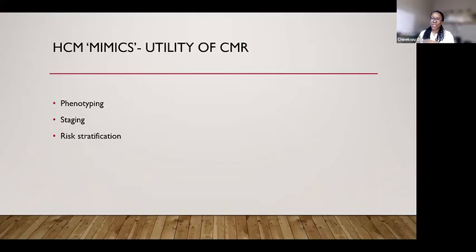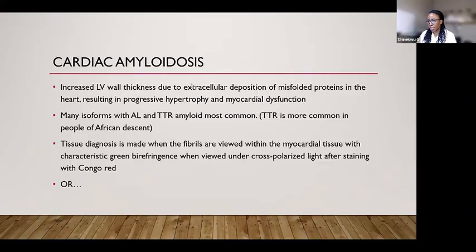And I think I mentioned in our slide, the last week or the week before, that most Kaplan-Meier curves on late gadolinium enhancement and its prediction of adverse outcomes look the same. Patients without late gadolinium enhancement experience outcomes in a gradual, low slope fashion. Patients with late gadolinium enhancement experience worse outcomes, and we'll see a few of those Kaplan-Meier curves. And the more the LGE, the worse the outcomes, the higher the occurrence of adverse outcomes.